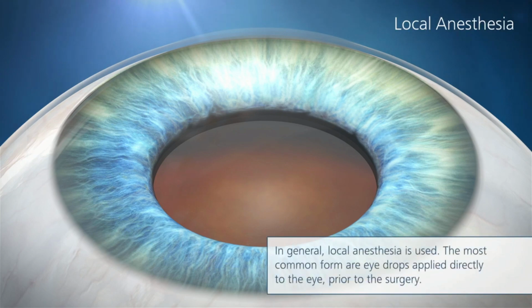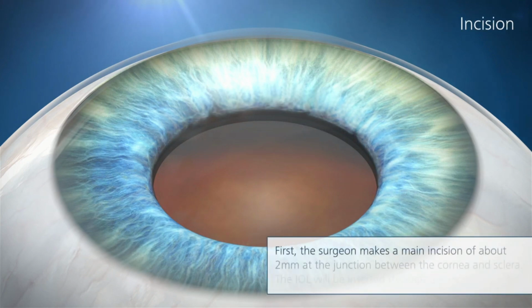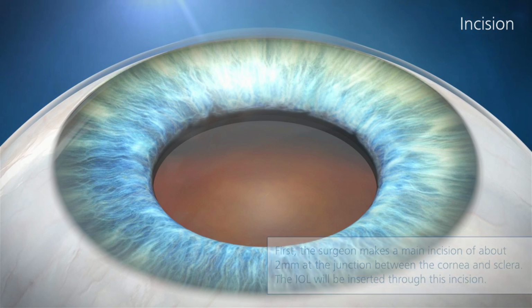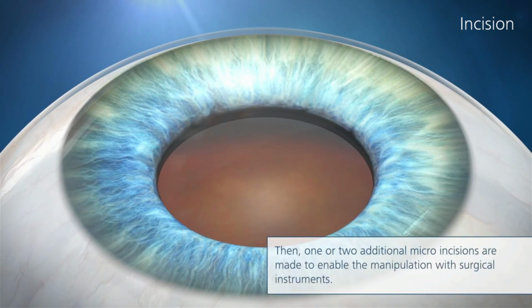In general, local anesthesia is used. The most common form are eye drops applied directly to the eye prior to the surgery. First, the surgeon makes a main incision of about 2 millimeters at the junction between the cornea and sclera. The intraocular lens will be inserted through this incision. Then 1 or 2 additional microincisions are made to enable the manipulation with surgical instruments.